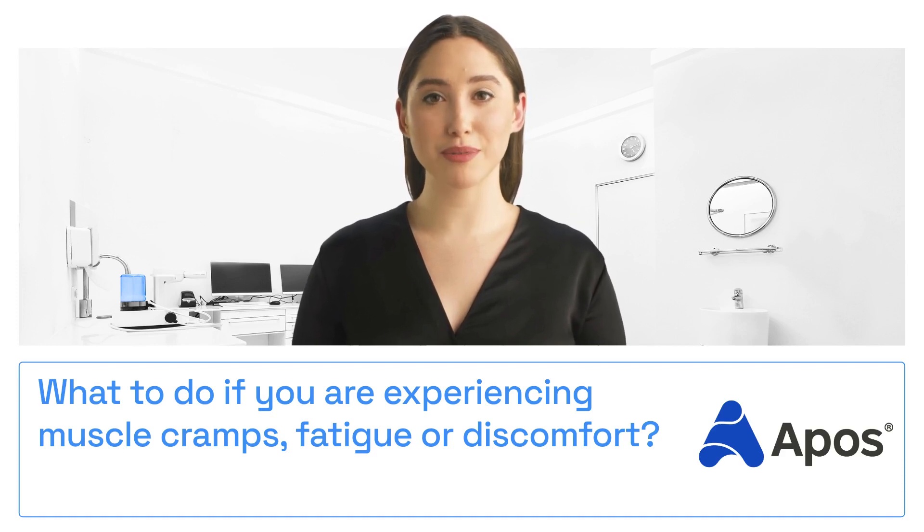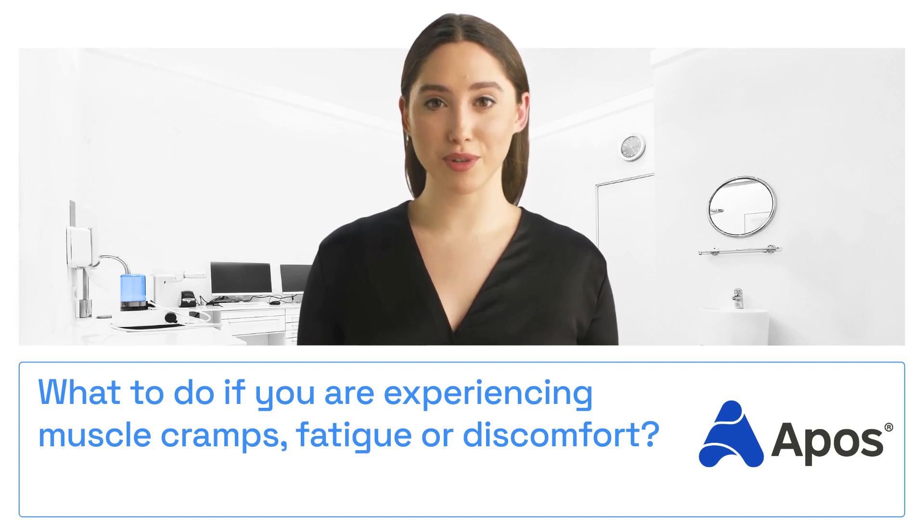If you ever feel uncomfortable, you can make it easier on yourself. Wear the Apos shoes for less time, or take more and longer breaks. Sometimes less is more.